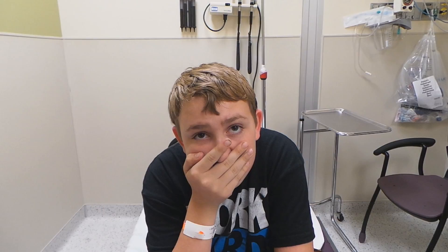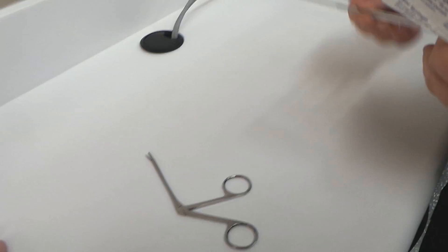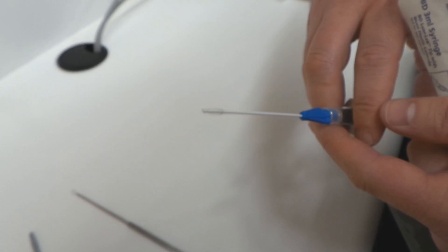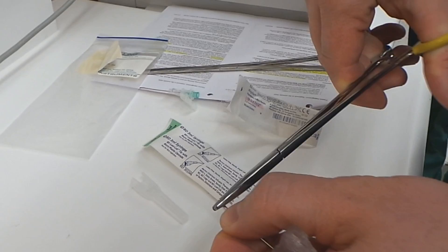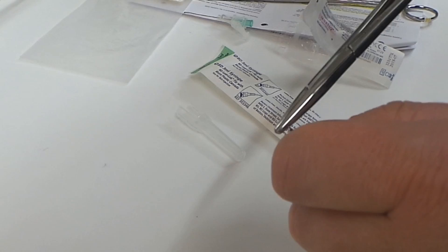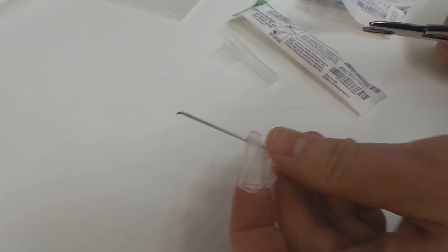All right, so we're going to look at the tools we may be using. You've got your alligator forceps, and you've got your cat's extractor — testing that the balloon comes up. And then you're making something here. What are you doing? So we've got an 18-gauge needle and we're just going to put a little 90-degree bend in the tip — making a little hook that might snag onto the eraser. Yeah, that looks like it'll work. That's perfect. You want to try that first, then the cat's extractor after.